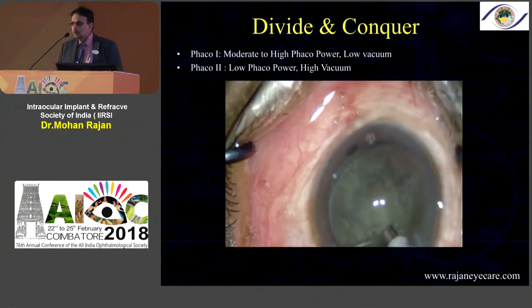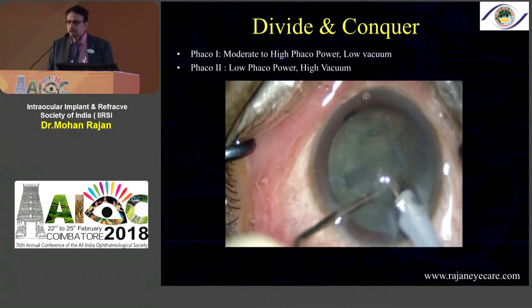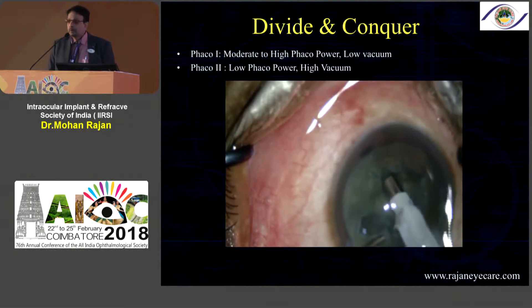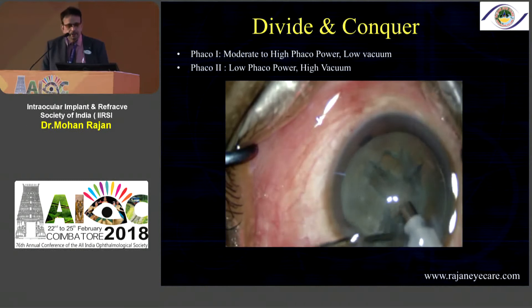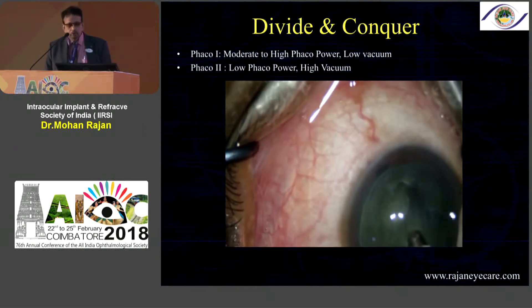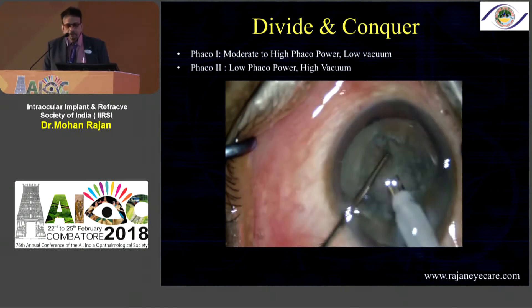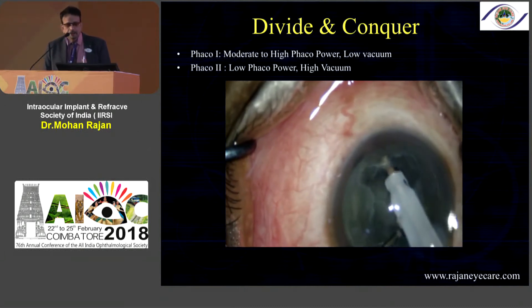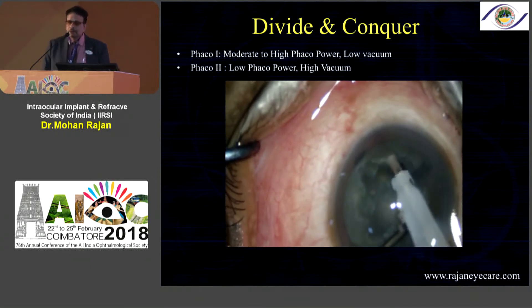For a little harder cataract you can do what is called divide and conquer. This is how we learned FACO — we do four quadrants, something like a Maltese cross. You use moderate to high FACO power depending on the density of the cataract and make the trench almost until you see a good red glow. That is one of the most important things to understand in divide and conquer. Once you have a uniform red glow at the bottom, you can go ahead and crack the nucleus into four quadrants — that's why it's called divide and conquer.